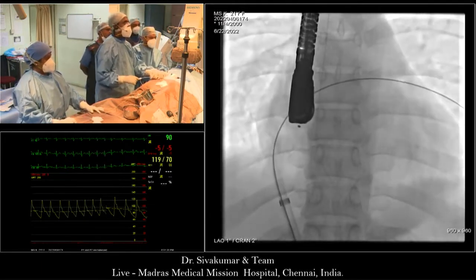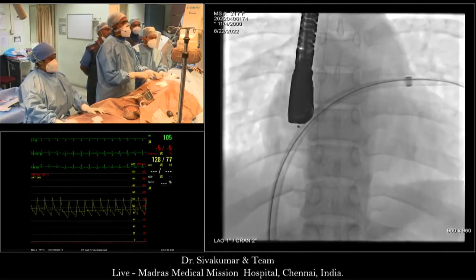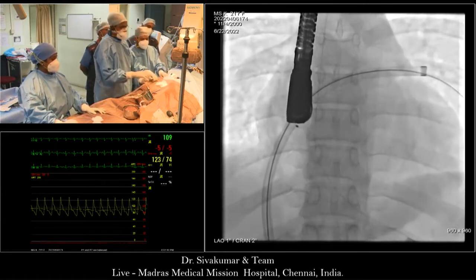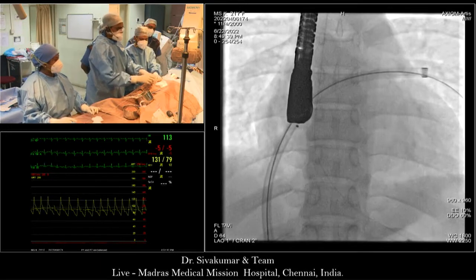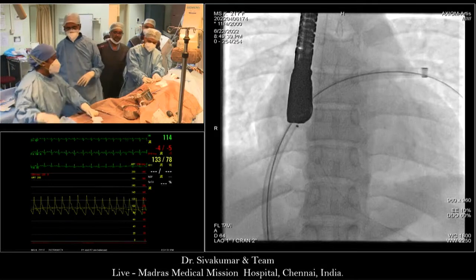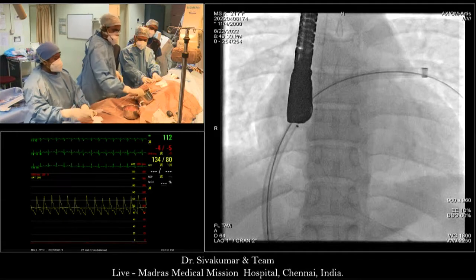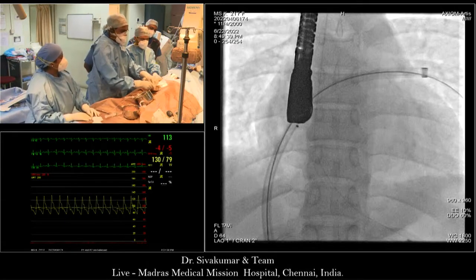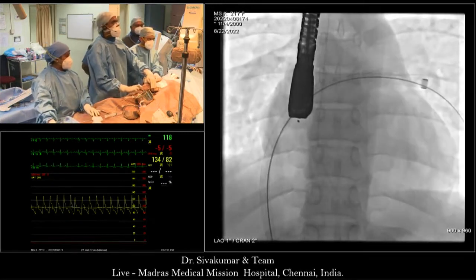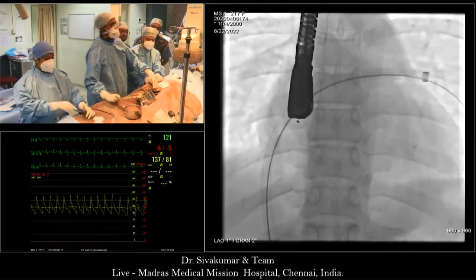38? I think that modification of the implantation can make a difference. That's the issue. So what would you do now, Mario? Well, you all know the other modifications of the implantation: right upper pulmonary vein deployment, balloon assisted deployment, all that stuff. They can make a difference. But certainly I will try for the third time a 36 instead of 40.